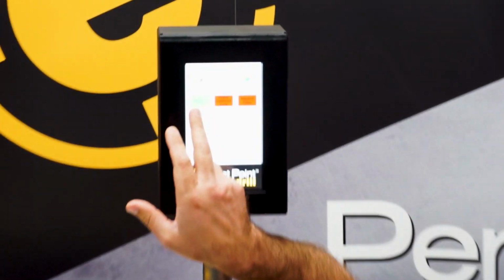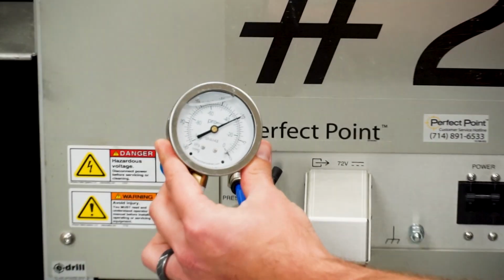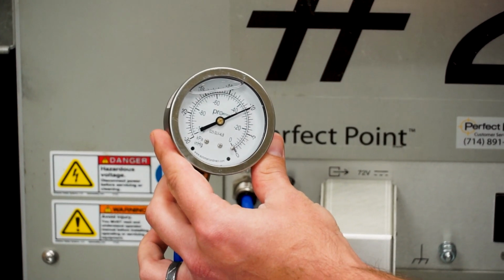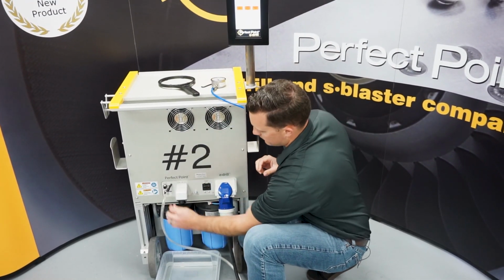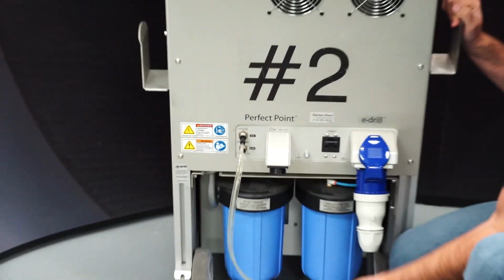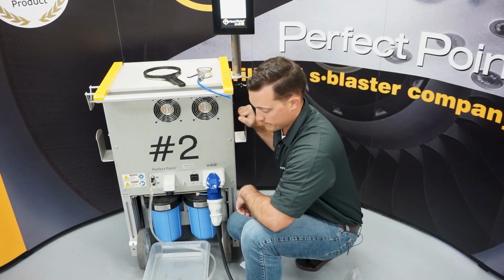So we're at 10 inches of mercury, hit top off, it stops the pump from working. Our gauge stays right there, we've got a nice strong vacuum. Remove the gauge, set it aside, plug our tubes back in, run top off, and fill it up with water.